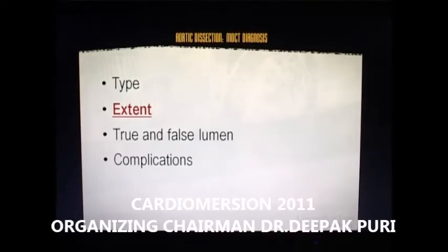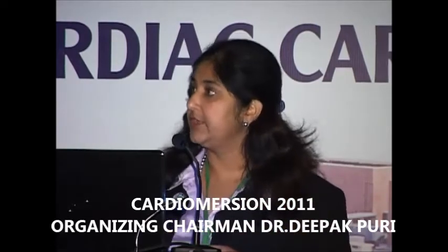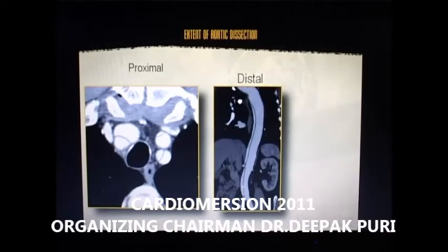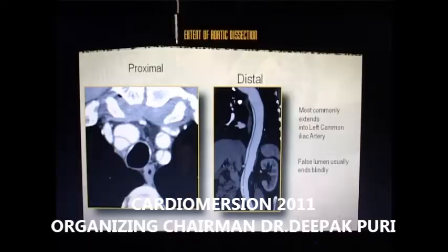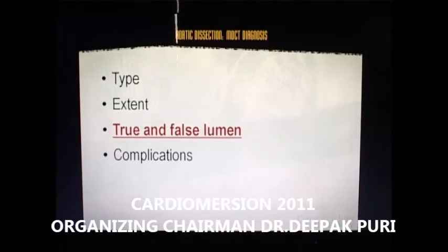Now, the extent of the aortic dissection, we can give very clear information about the proximal and the distal extent of the aortic dissection, which comes in very handy to our surgeons. As in this case, we are demonstrating that all the three branches of the arch of the aorta are involved with the dissection flap, and in that case, we often go up in our imaging to see the cranial extent of this dissection flap, or if it is getting into the carotids, we can use Doppler for evaluation. And this is demonstrating the distal extent of the aortic dissection in the descending thoracic aorta. As you can see, this is the bifurcation.